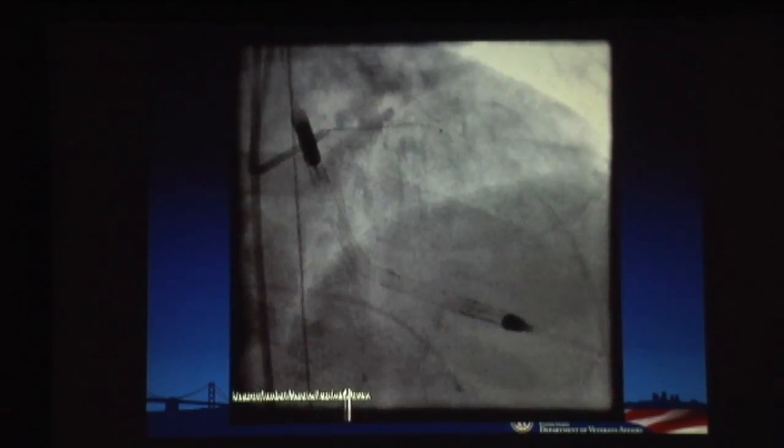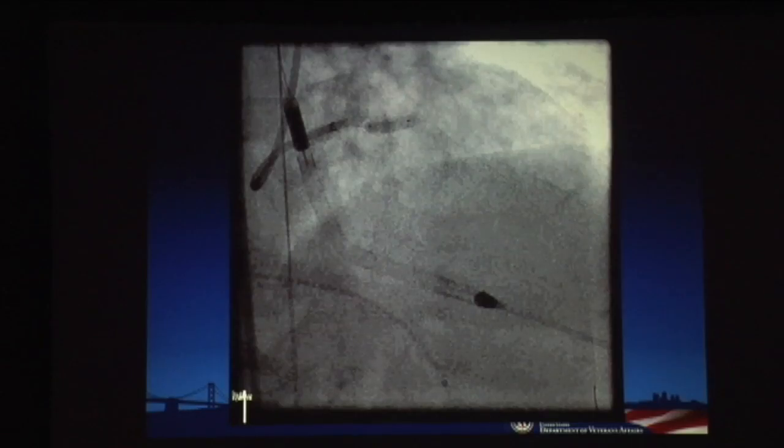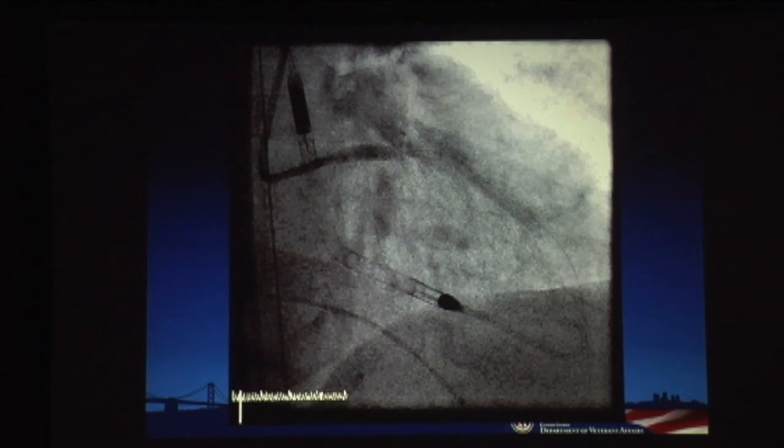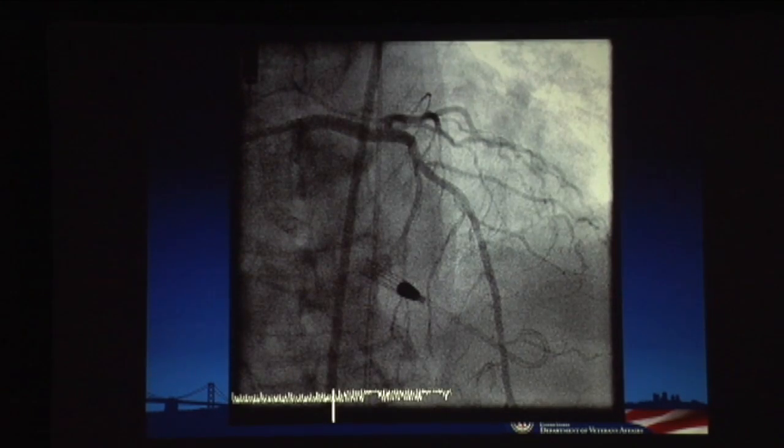This is just positioning the stent, so this is a long drug-eluting stent that's going to jail off the circumflex, but that's okay, we think. So we deploy the stent, and then we take a couple pictures after the stent, and we decide that we better make the left main portion bigger because we've already seen on OCT how big it is. No left main is really 3.0, so we make that bigger with some post-dilatation. And I'll show you, I guess this one won't play, but that's the final.